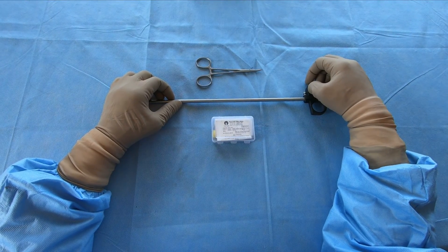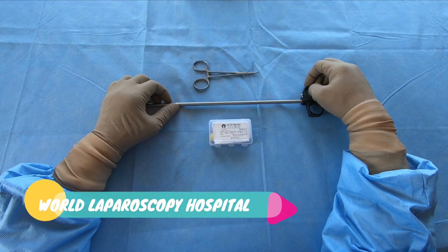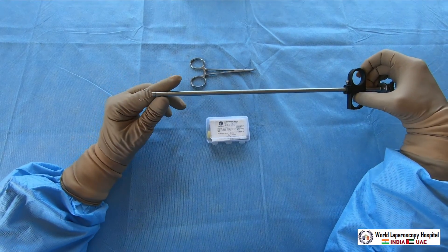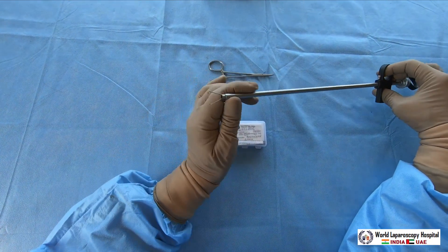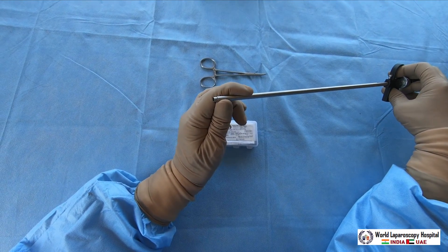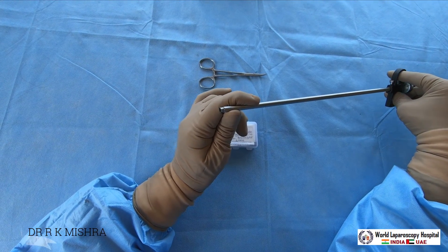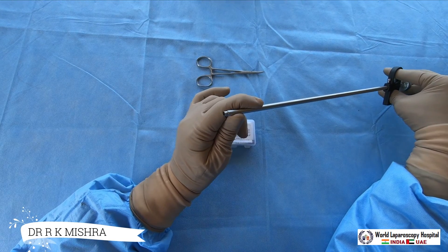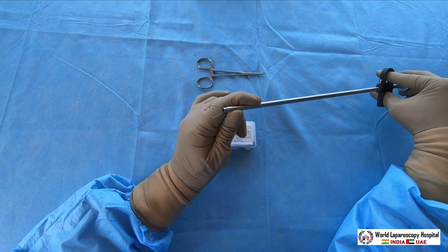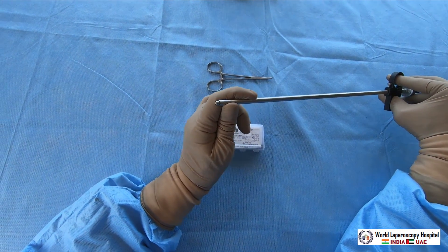Hello friends, today I am going to demonstrate the fallop ring applicator. The fallop ring applicator is a very useful instrument for tubal sterilization. It has a jaw to catch the tube, and once you pull it, the ring will be applied. If you search on YouTube for laparoscopic tubal sterilization with the fallop ring applicator, you can see my videos of live surgery. But this instrument demonstration is very important.